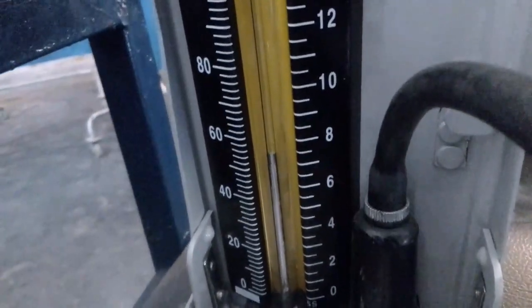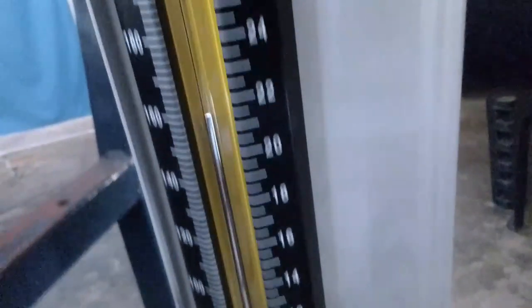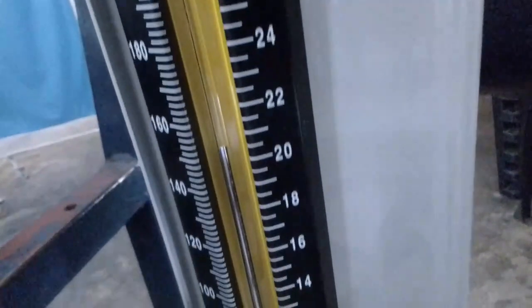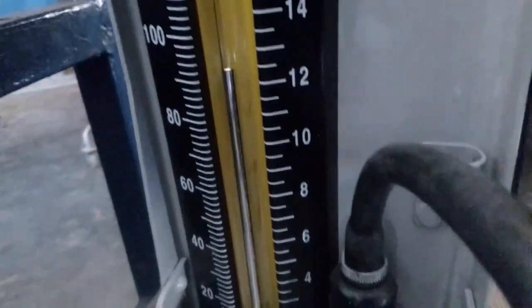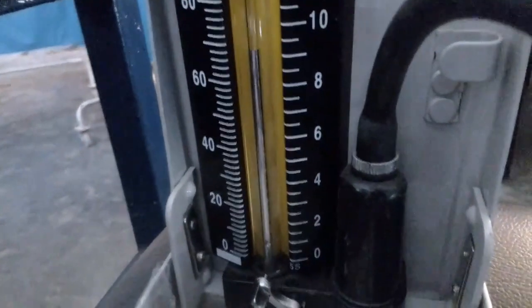So if you want to be sure, at least do it twice. So you can lock again and pump. Go up to where you stopped filling it. Then again start. So the mercury is dropping. So it starts bouncing again there. Then there it goes quiet. It reduces in the intensity of sound and then it has gone quiet.